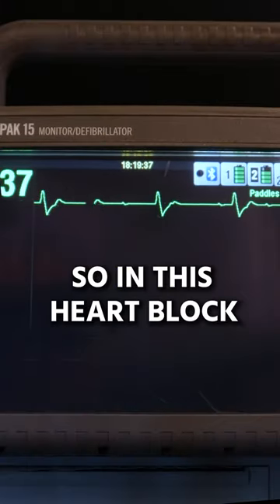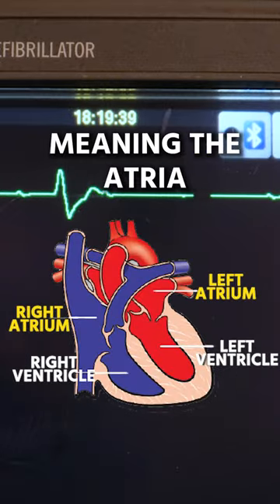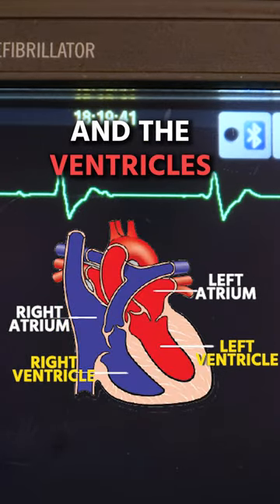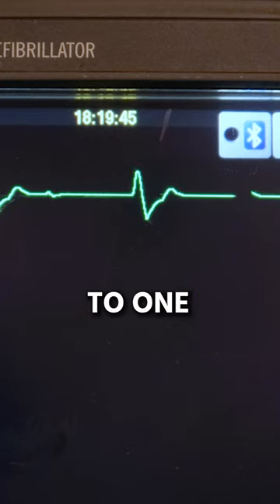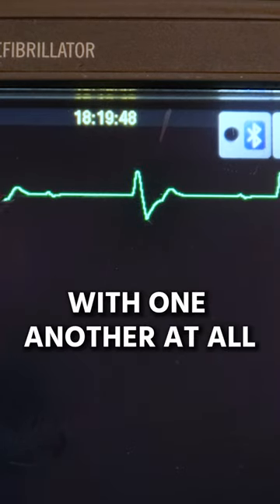So in this heart block, the P waves, meaning the atria, and the ventricles, QRS complex, they are not speaking to one another. They're not in coordination with one another at all.